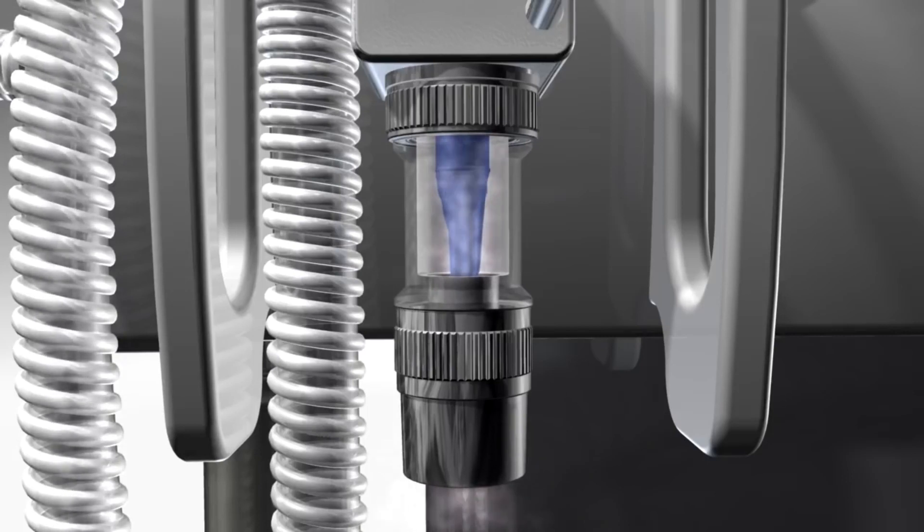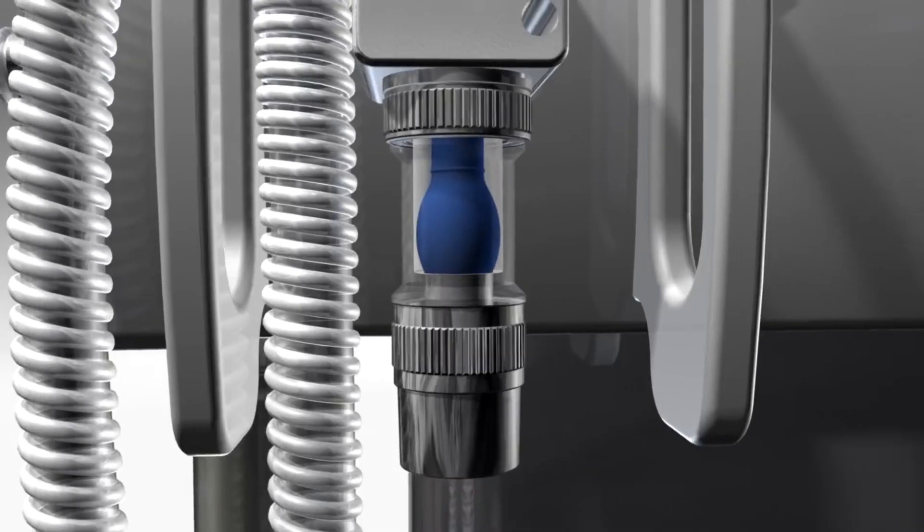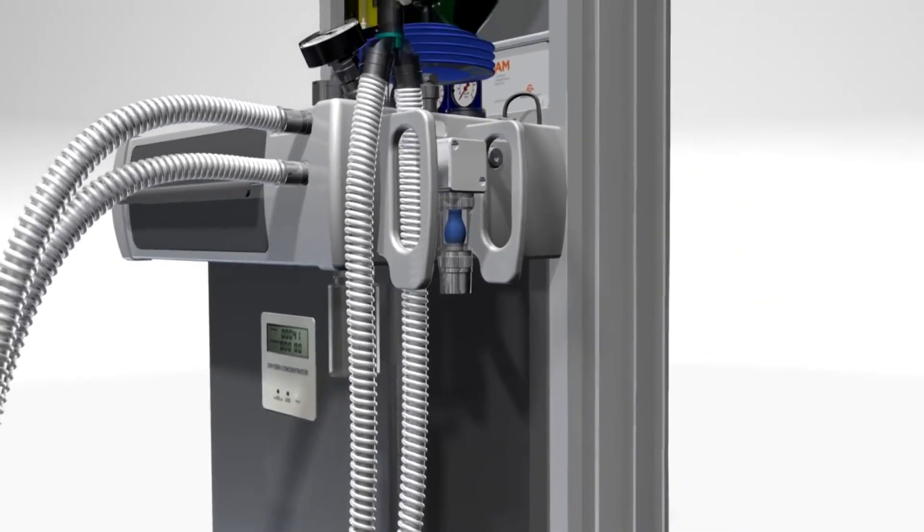Scavenging may be active (suction applied) or passive (waste gases proceed passively down corrugated tubing through the room ventilation exhaust grill of the OR).